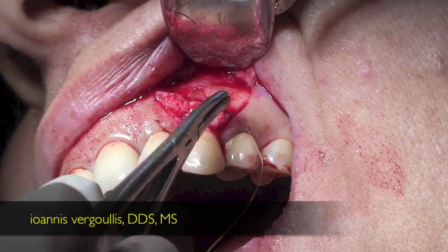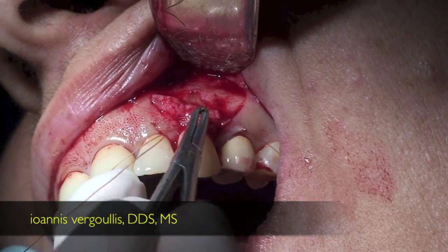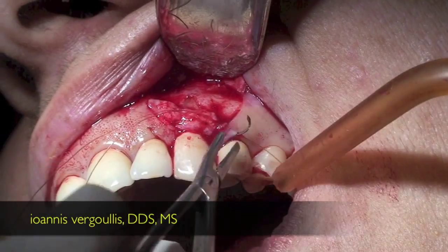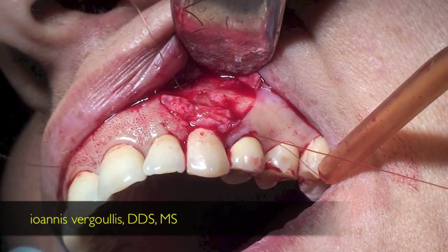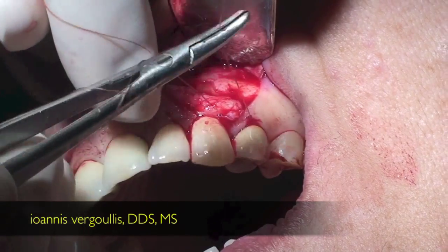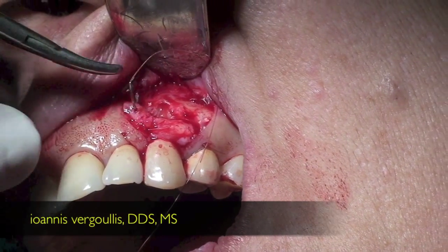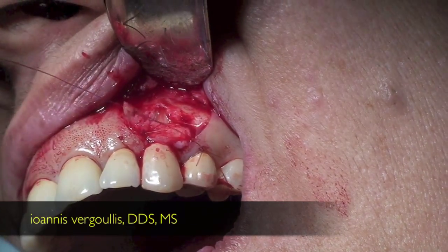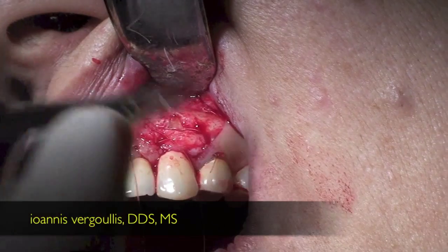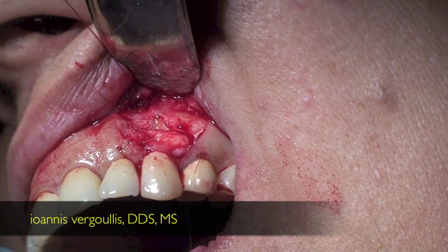We can also start from outside of the flap, grab the connective tissue graft and come outside of the flap. In this way, we put the knot outside of the flap. I have seen no difference between the two techniques in the result. However, most of the times I prefer to do the second as I feel more comfortable having the knot sitting outside of the flap and not interfering with the flap adaptation over the site.